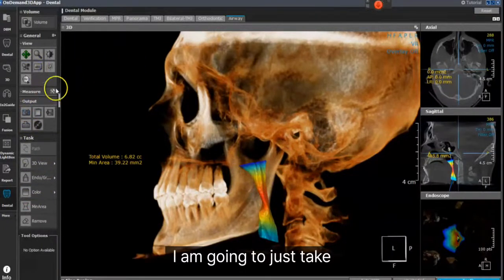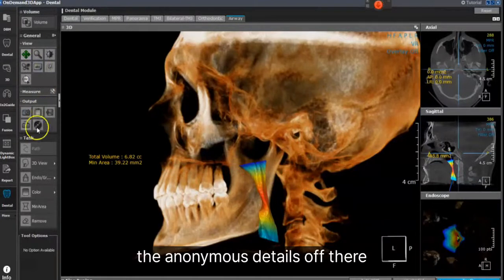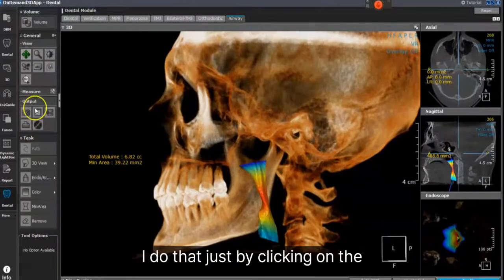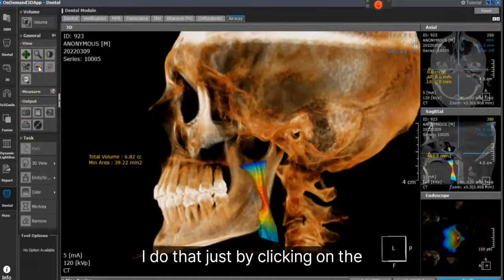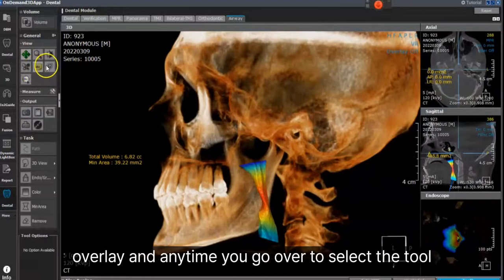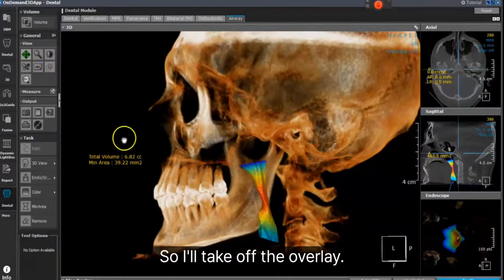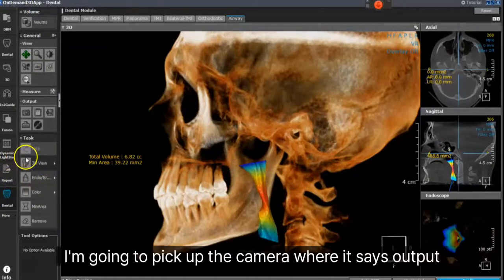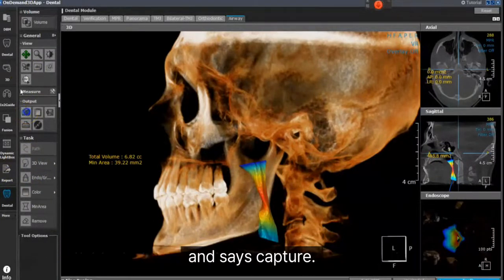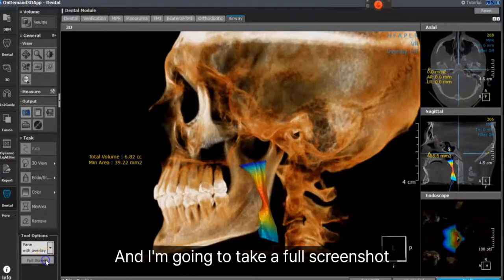I'm going to take the anonymous details off there — I do that just by clicking on the overlay. Any time you go over to select a tool, it'll tell you what it is. I'll take off the overlay, then pick up the camera tool which says Output, and it says Capture. I'm going to take a full screenshot.